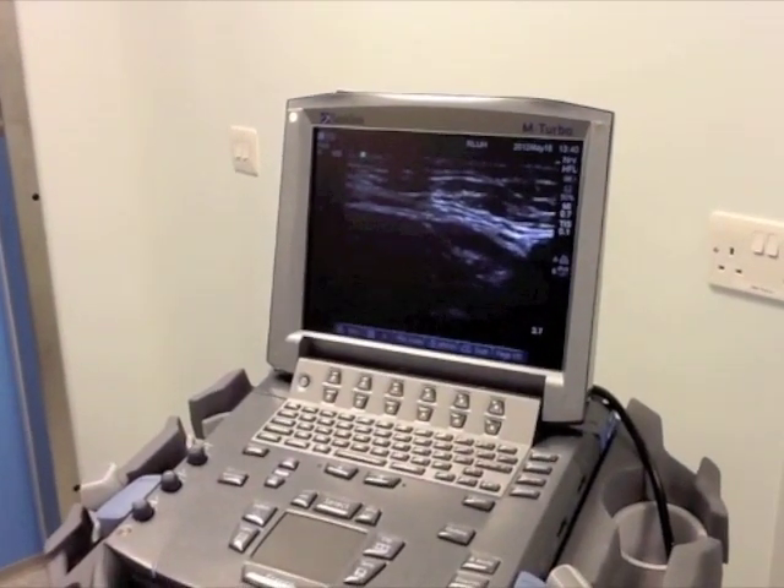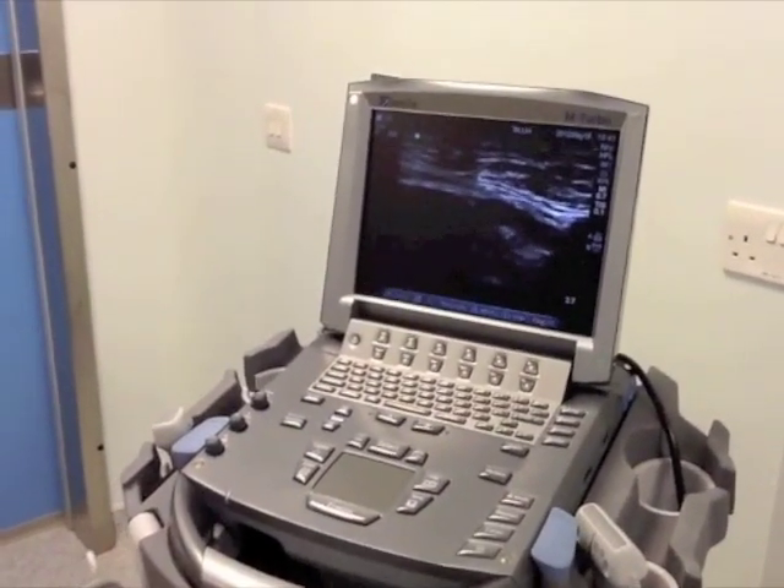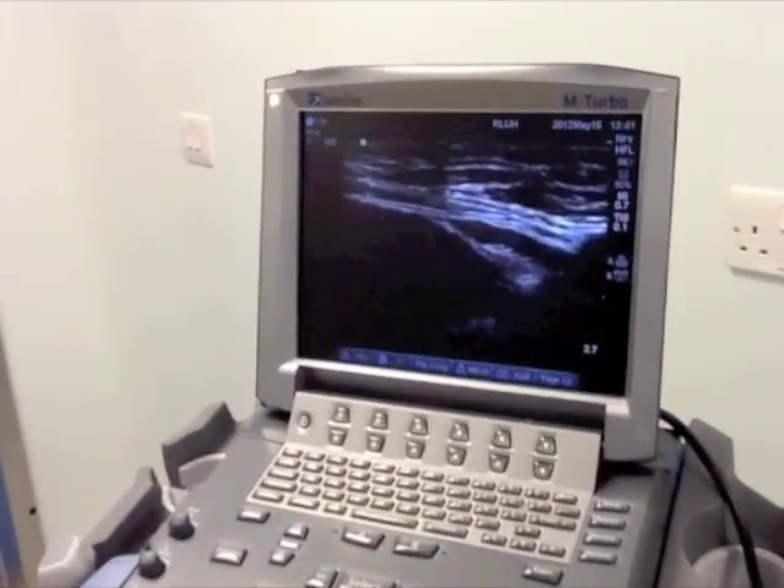But if it does not, the needle is withdrawn and the local anesthetic is deposited anterior to the nerve.